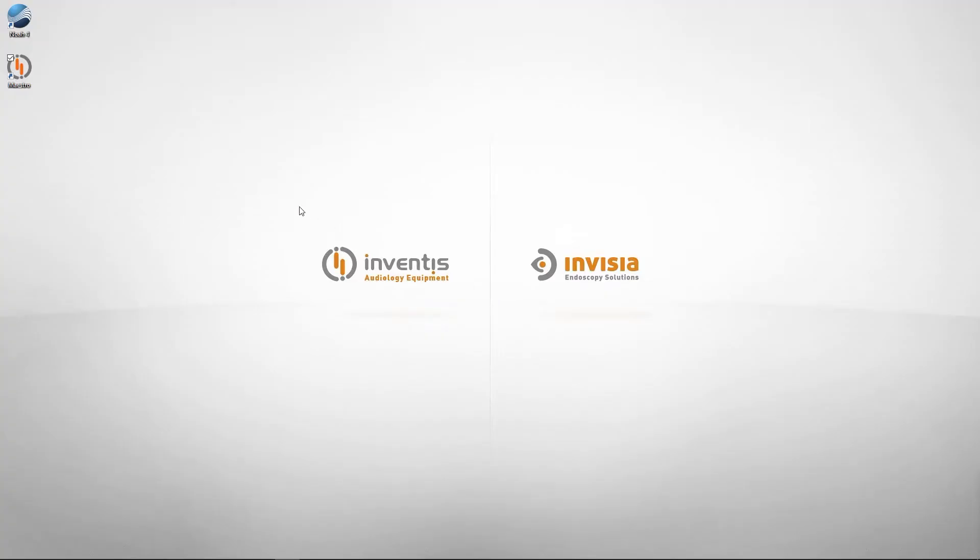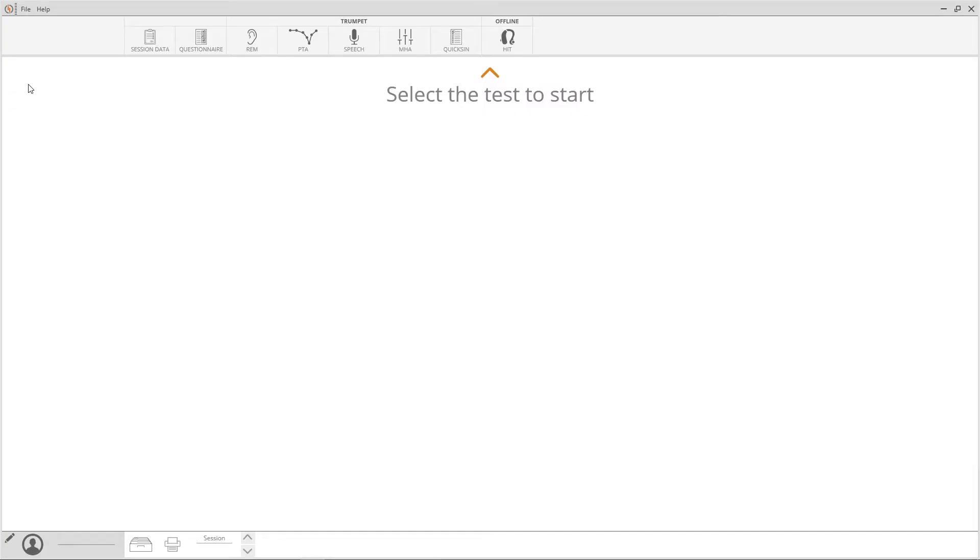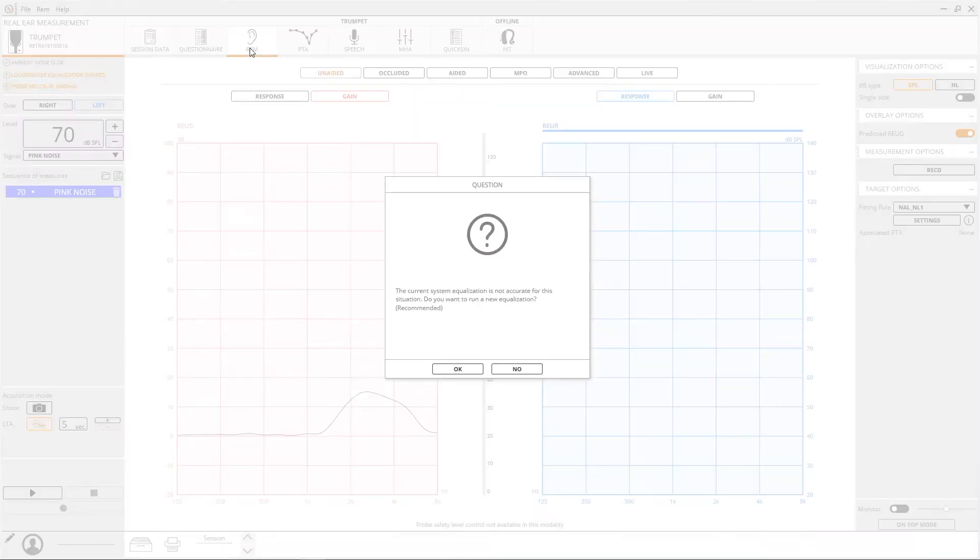We have to instruct our patient to sit in front and face the Trumpet speaker. To start, double click on the Maestro icon and the software will open. Exams available will be shown on the upper part of the software. Select REM to access the in vivo tests.